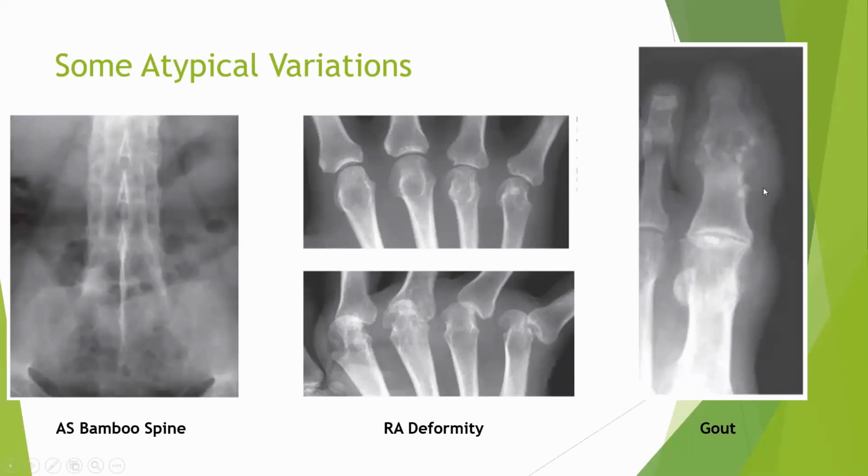And over here you can see gout. Gout is nothing but these spots of uric acid crystals. Uric acid crystals right over here, deposition of uric acid, a big node of uric acid over here. And this essentially tells us that this person is suffering from gout.